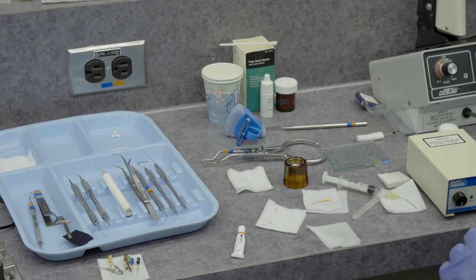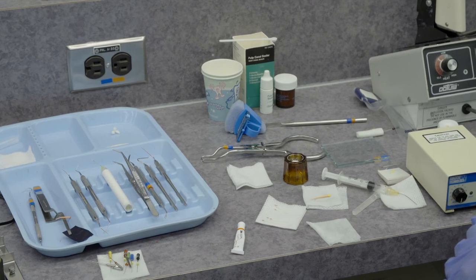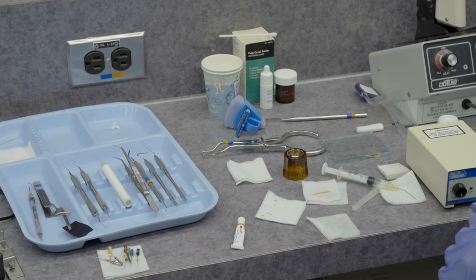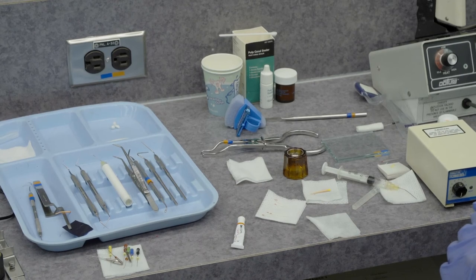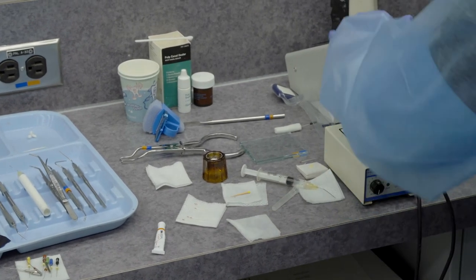Now we've finished with the removal of the guttapercha, the extra guttapercha. Now we're going to get ready to backfill with the obturation. So sometimes a dentist will use small cut up pieces of guttapercha with the touch and heat, but today we're going to use the guttapercha pellet gun.